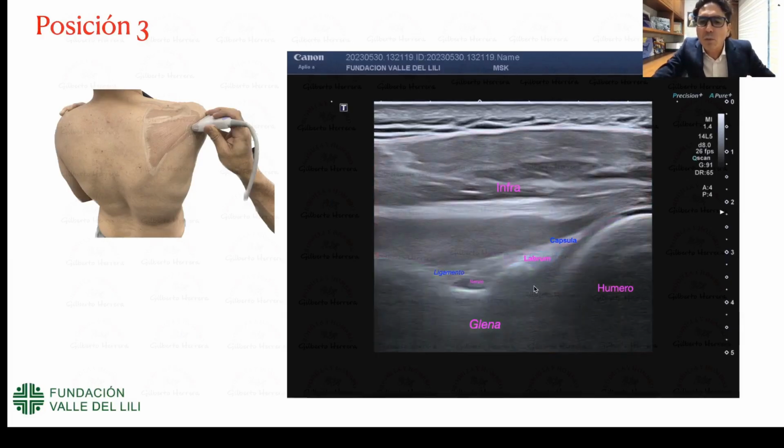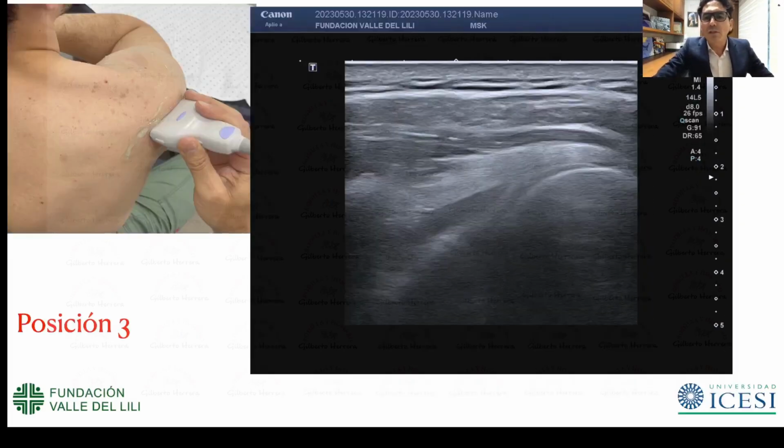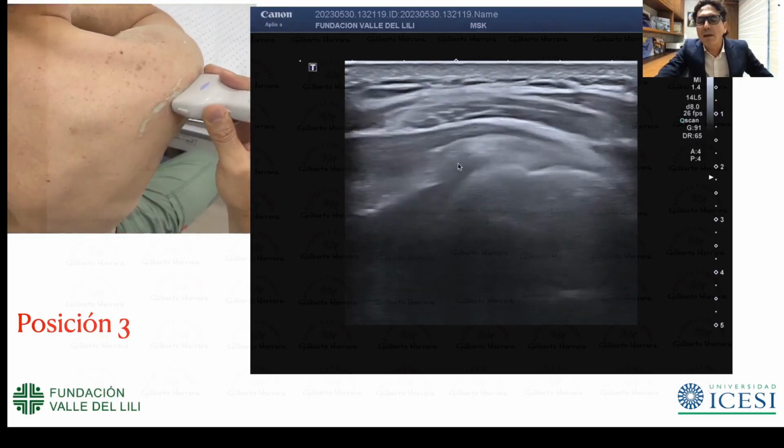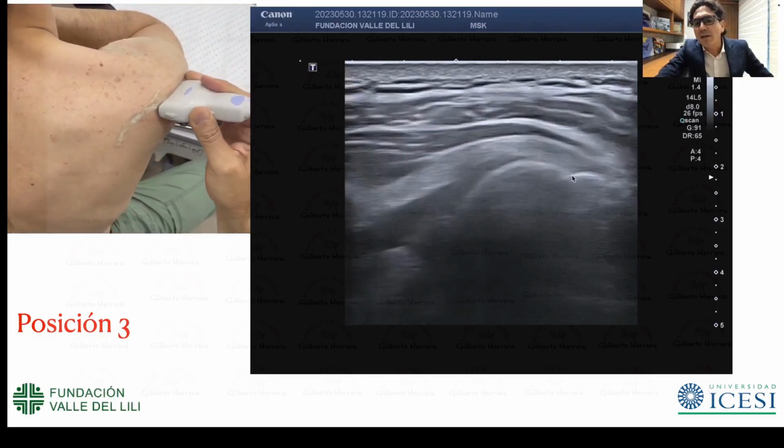Basically a drawing where we similarly write down the findings, ultrasound, so that we can later understand it dynamically. So in the long axis of the infraspinatus, we locate our spine, below the spine. Our probe is placed here, and this is the first image we are going to obtain, where clearly then the infraspinatus tendon is inserting at its footprint.